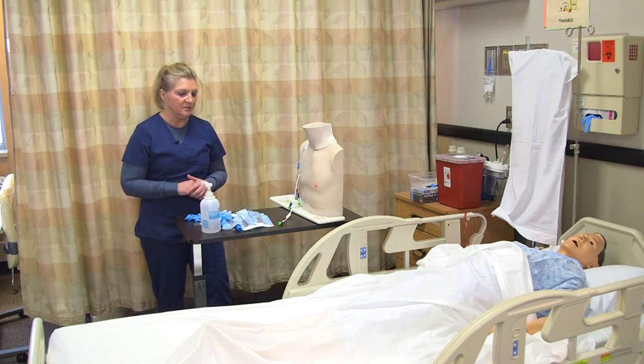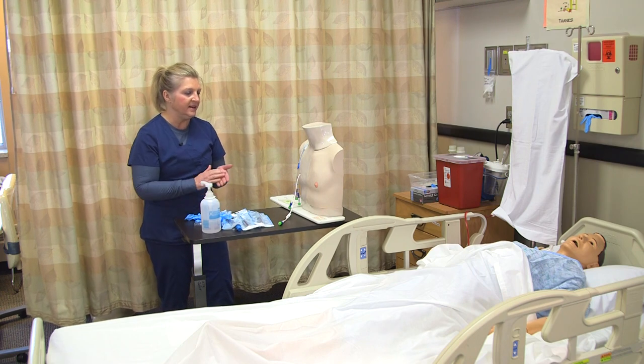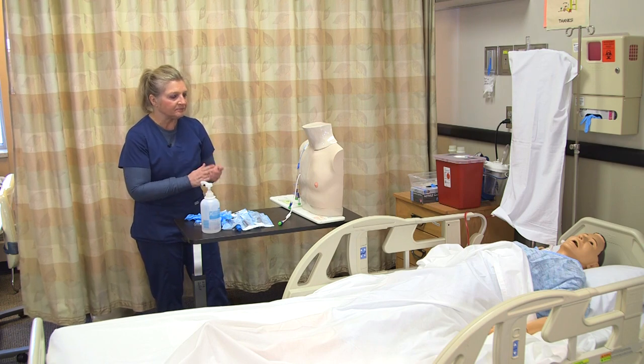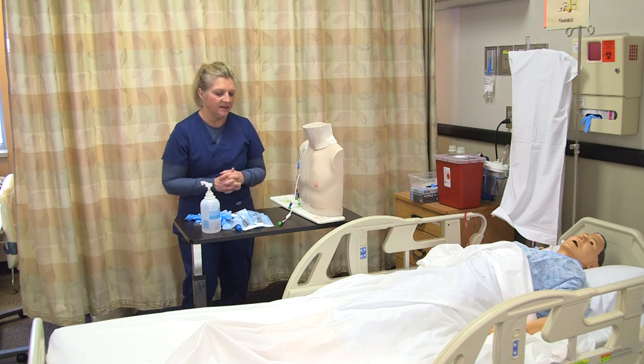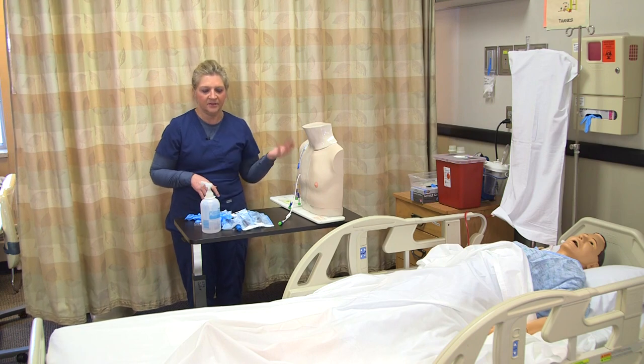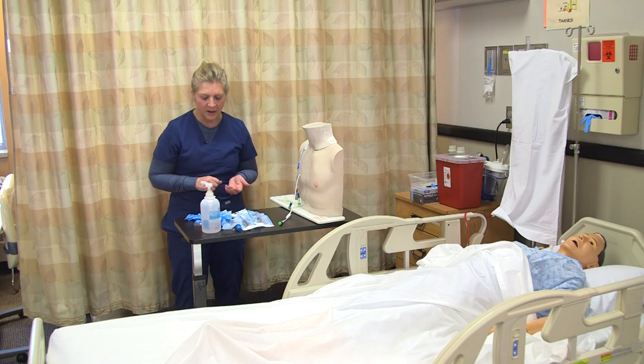When I go into the room, I'm going to make sure that I wash my hands, introduce myself, provide for privacy, and identify my patient with two identifiers. I'll also confirm any allergies the patient may have and confirm the identity with my EMR.